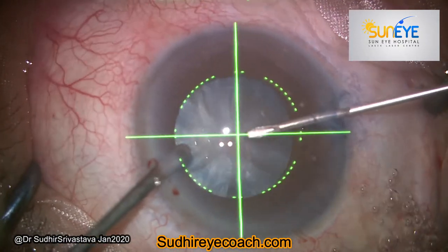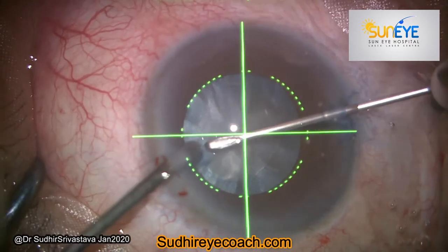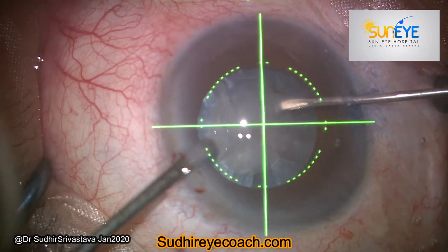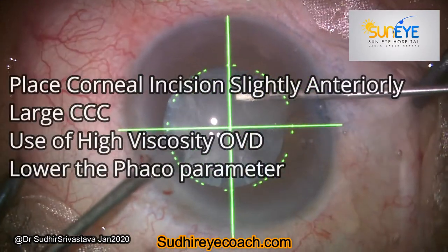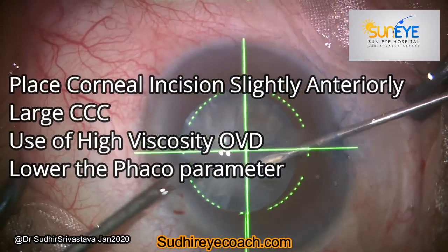If you are making an incision, always try to make a crisp and small incision and place it slightly anterior in the cornea. Always try to make a bigger capsulorhexis size.